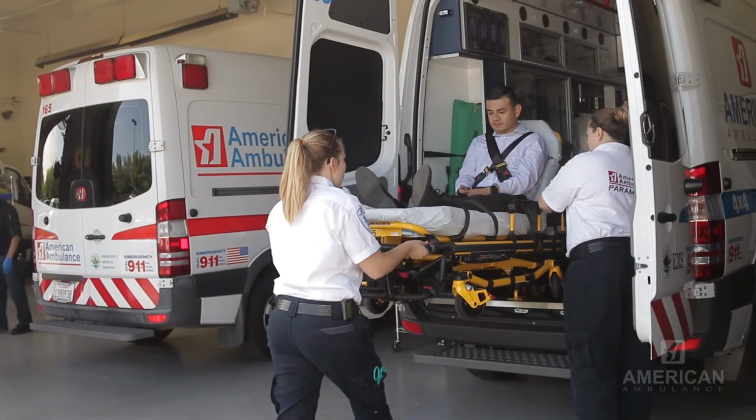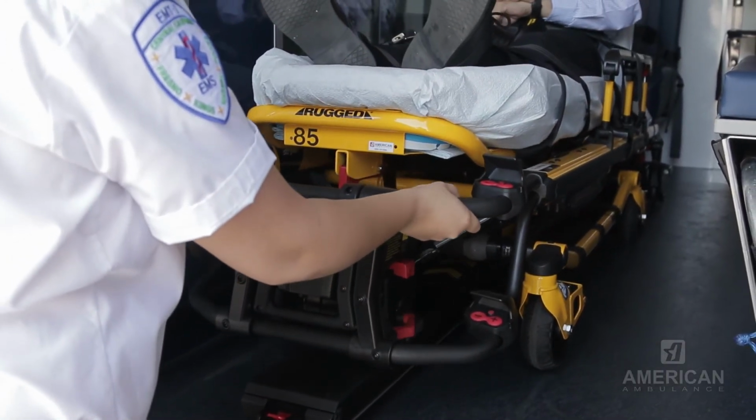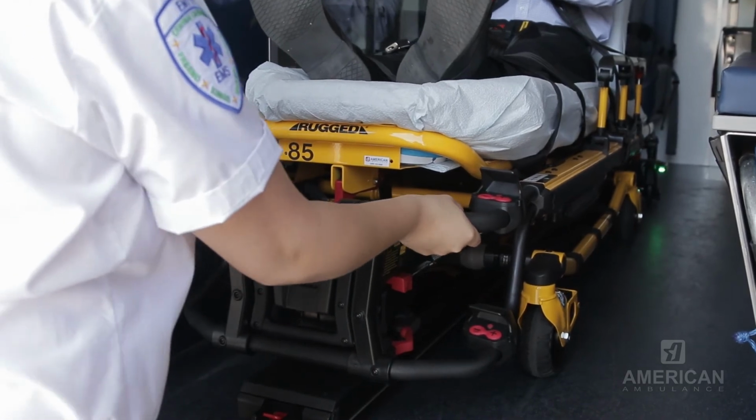Once the legs are in the upright position, we can then glide the gurney into the ambulance. Before we walk away, just jiggle it, make sure it's in the proper locking position. Paramedic can step into the back of the ambulance, and we can shut the doors and move that patient to the hospital.